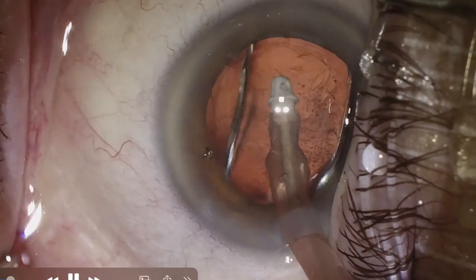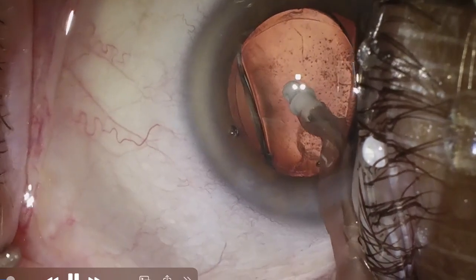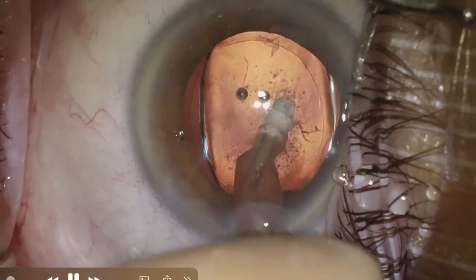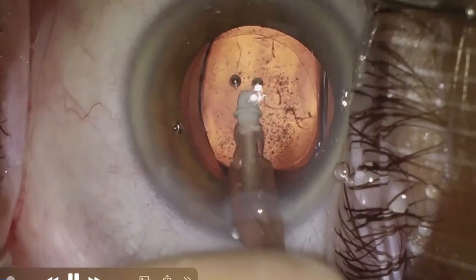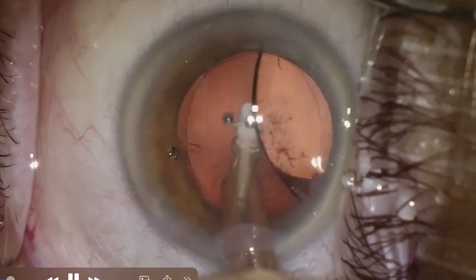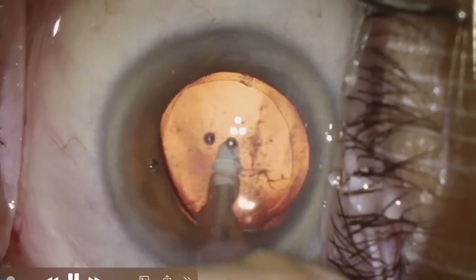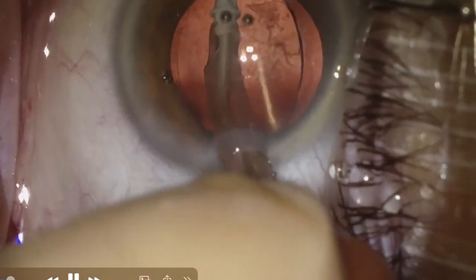Irrigation just turned on. Aspiration, we're using a high aspiration setting to remove the viscoelastic. There's some cortical fragments there. We're going to get those as well. And once we have removed most of the viscoelastic, we'll go to a cortex removal mode, which has a slower rise, giving more control over the aspiration rate and vacuum here. And we'll go behind the intraocular lens, remove any viscoelastic maybe behind the intraocular lens. And all that material you see there on the right of the screen, that's all in the cornea.